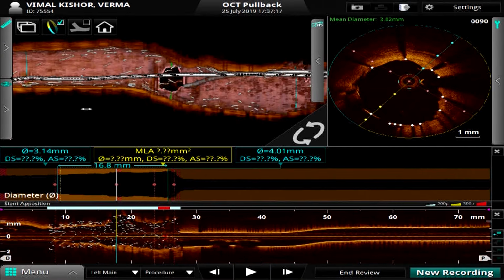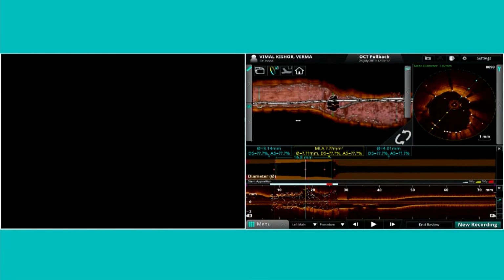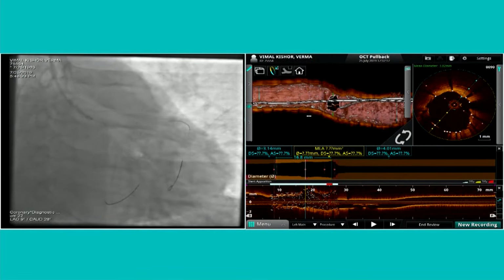Can you clear the stent? A little back side. OCT is a very powerful tool post-stent compared to IVUS, right? You talked about the benefits of IVUS pre-stent and some of the assessments. It's also very scenographic, it looks very catchy, attractive. Clear the stent again. Beautiful pictures. The only place where IVUS could be preferred is in ostial involvement like this, where sometimes there could be a challenge.